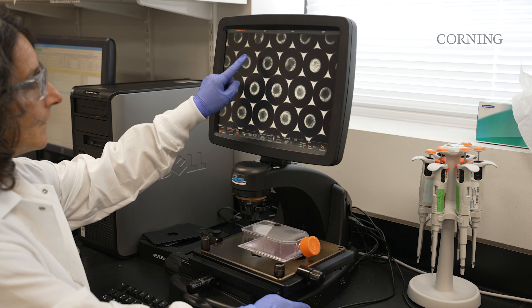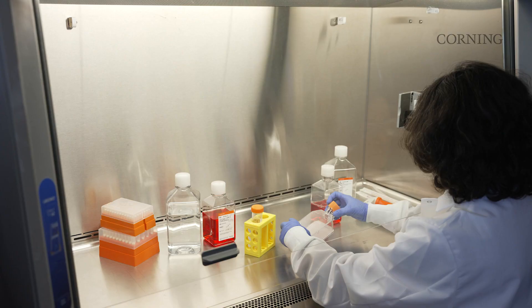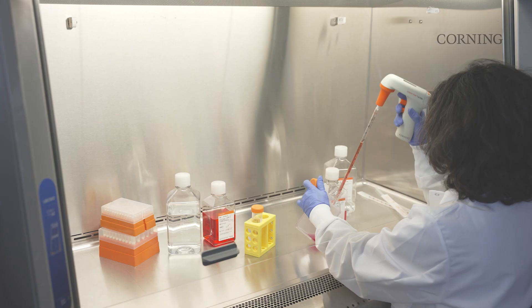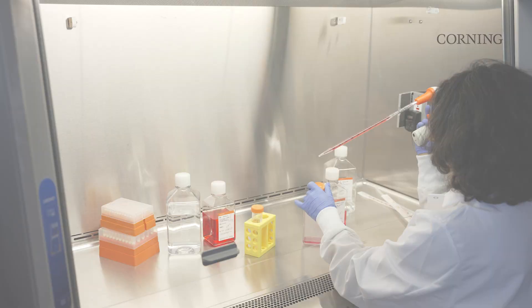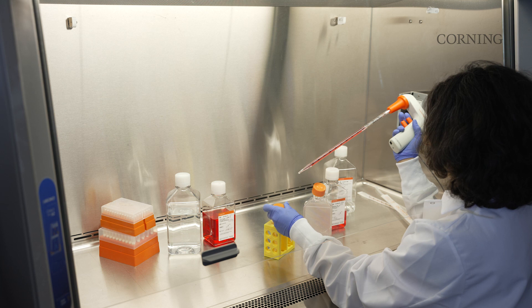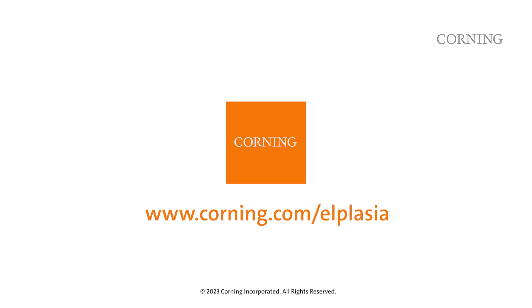Bring the flask to the upright position to release the spheroids. Pipette the suspension up and down several times to dissociate the spheroids. Dilute the dissociation solution with an equal volume of quenching solution, usually serum-containing growth medium, and transfer the cell suspension to a separate collection container. To ensure a single cell suspension, cells can be passed through a 70 micrometer cell strainer. To learn more about the Corning Elplasia 12K flask, visit www.corning.com/elplasia.